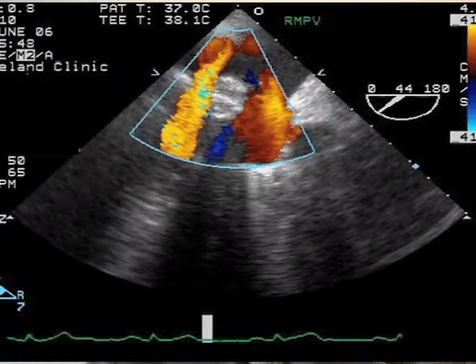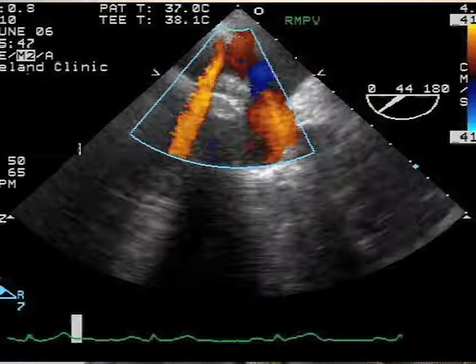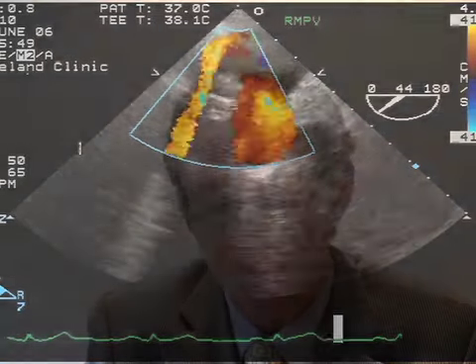What were the results of the study? We were able to enroll 43 patients in this study, and in terms of anatomy of the pulmonary veins, clearly CT was better than TEE for looking at the common left pulmonary vein atrium, and was similar to TEE for assessing the right middle pulmonary veins. With TEE, we were able to obtain 98% of veins, which is an important finding, with experienced operators. I'd like to show a movie of the separate ostium of the right middle vein, both by CT and TEE.